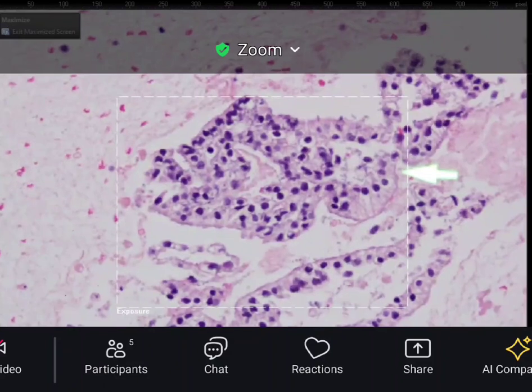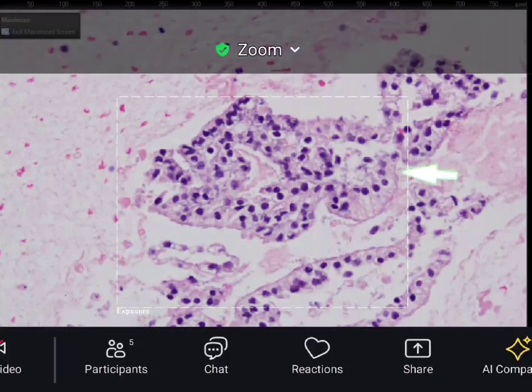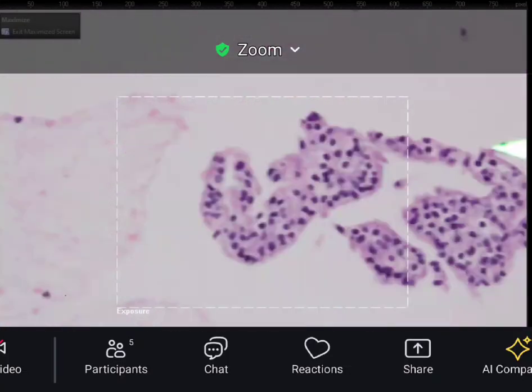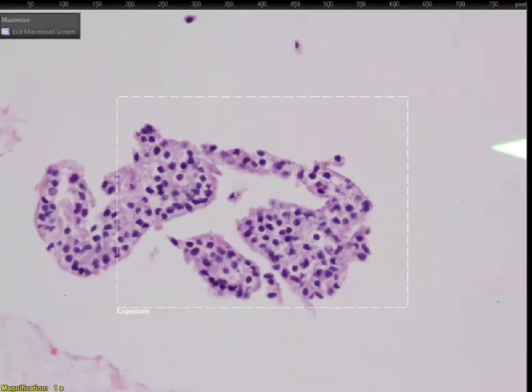Now when you see this, what do you think? It's better. Could a low-grade adeno present this way? Even they are not looking dysplastic. So what are you thinking, Dr. Molu?